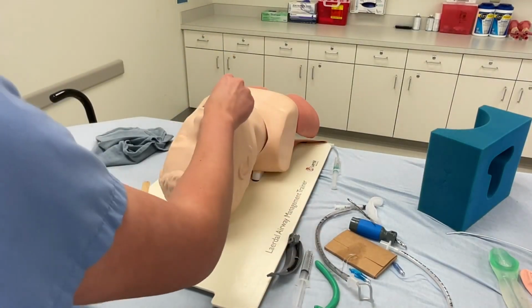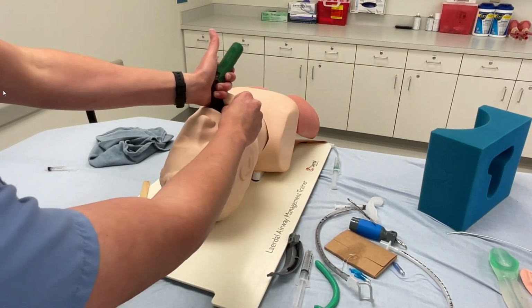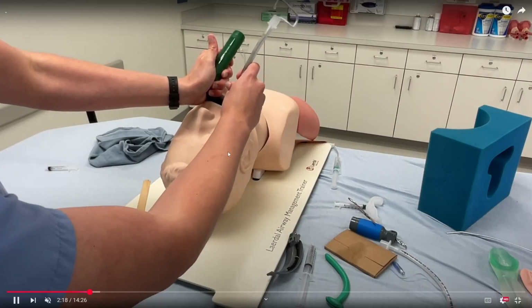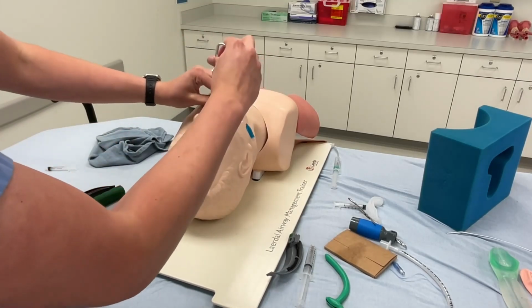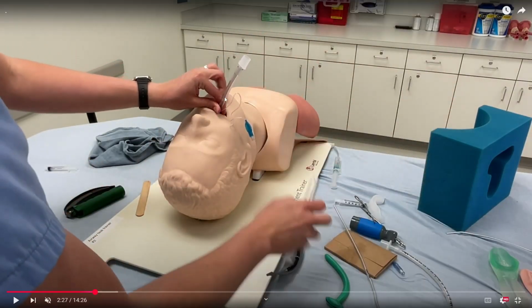Now, this is one that was very difficult to do with the camera over my shoulder, I have to be at a very awkward angle. You'll notice how my left arm is very outstretched. In reality, you do not want this. So I make sure I get a good view, insert the endotracheal tube, again having to be forceful because it's rubber on rubber, pulling out our stylet while making sure our hand is firmly securing the tube. It's very important.